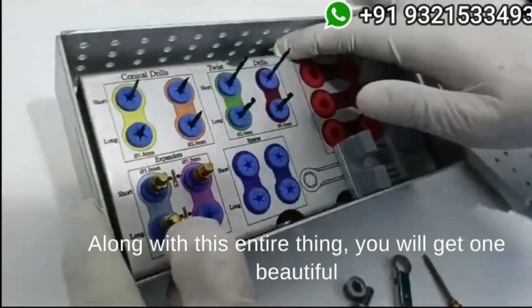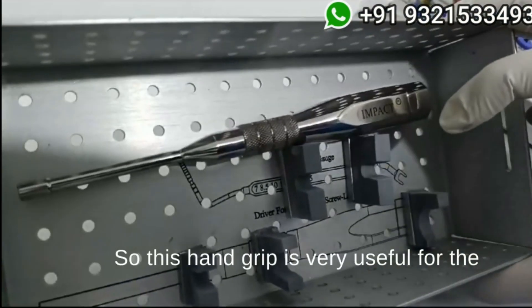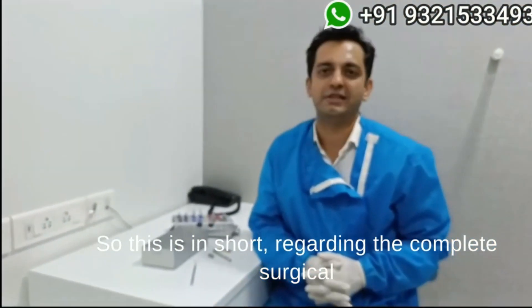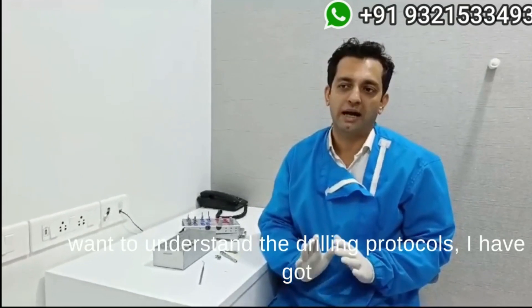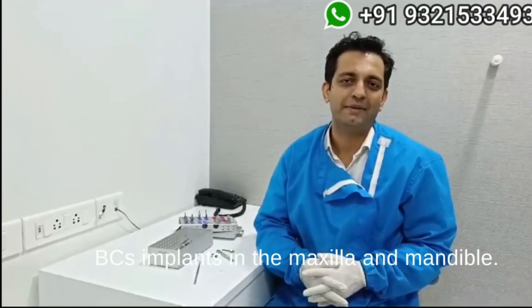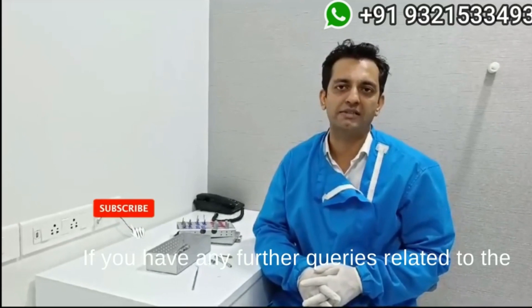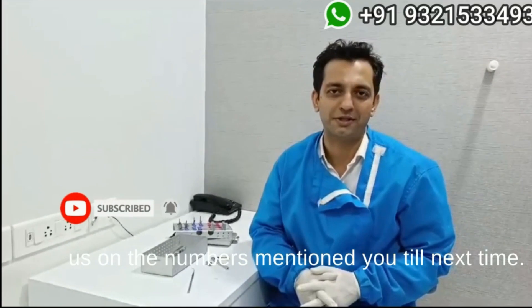Along with all of this, you will get one beautiful hand grip which comes as part of the kit. This hand grip is very useful for placement of the implants with hand drive. That's a short overview of the complete surgical kit for BCS and KOS. For those who want to understand the drilling protocols, I have separate videos on the drilling protocols of KOS and BCS implants in the maxilla and mandible. I hope this short video on the surgical kit of BCS and KOS cementable implants was helpful. If you have any further queries related to the R-line kit, feel free to connect with us on the numbers mentioned. Till next time, thank you.